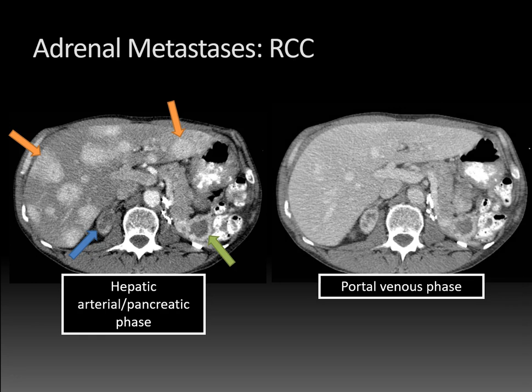This patient also has a later portal venous phase image where the hepatic veins are starting to enhance and the rest of the hepatic parenchyma is also enhancing. Notice that it's very difficult to see any hepatic metastases on this phase — that's why it's important to get a hepatic arterial phase image whenever there's concern for possible hypervascular metastases. You can again see the right adrenal metastasis and the pancreatic tail metastasis.